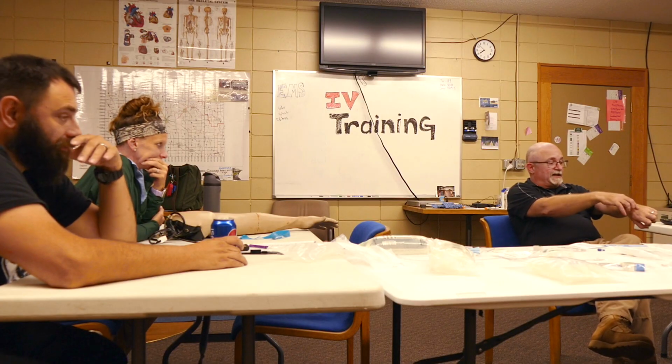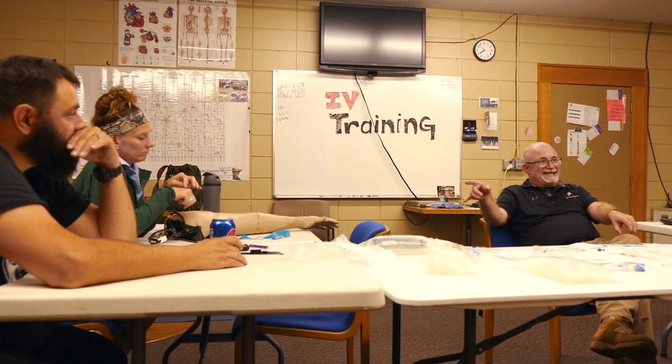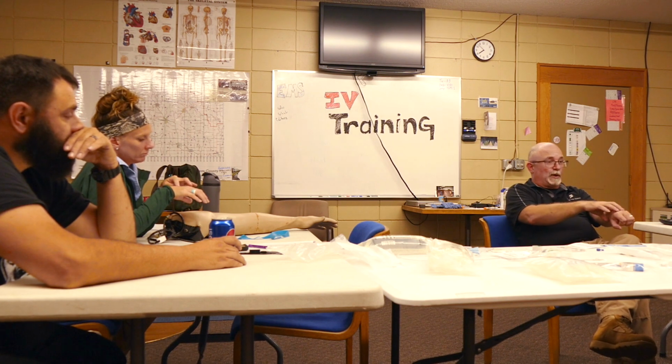So working back off of this, there's a number of veins that work on here, and I can bring up the chart, but you can see them just as well as I can. As much as seeing, feeling is how to decide where to go. For me, nice soft spongy, oh, I can feel that. Yep, I can see it, and great.